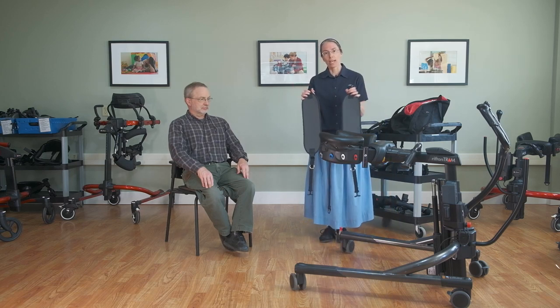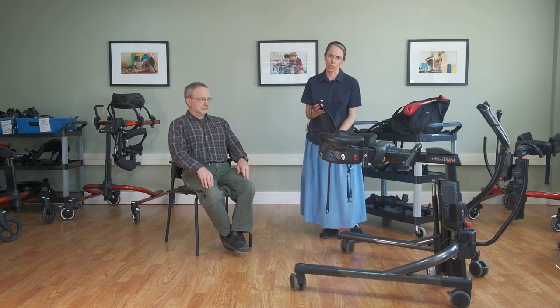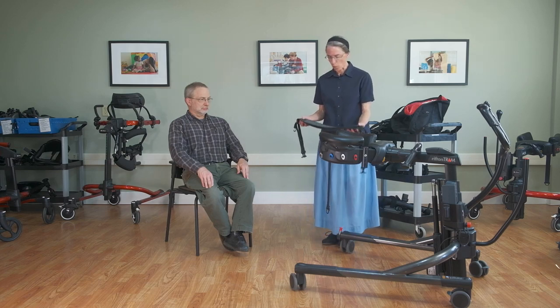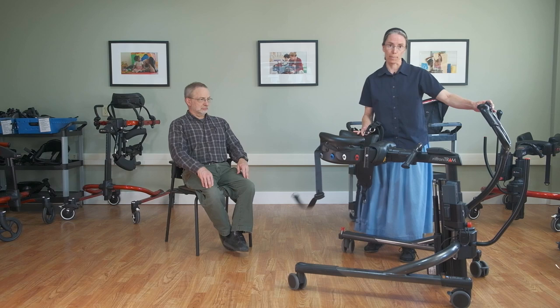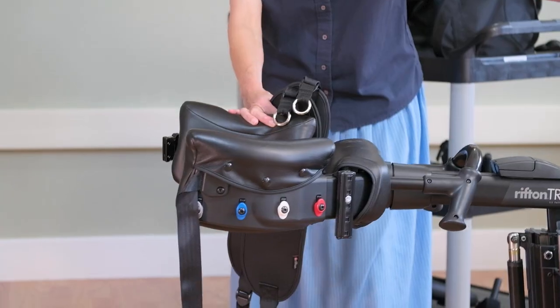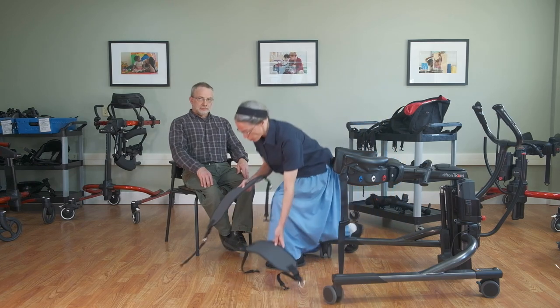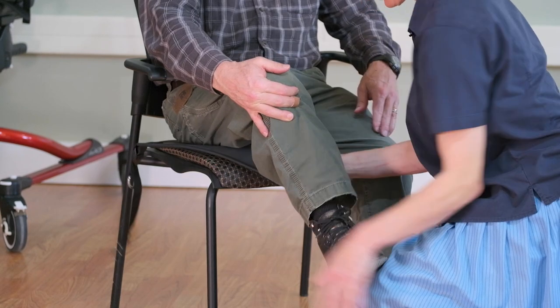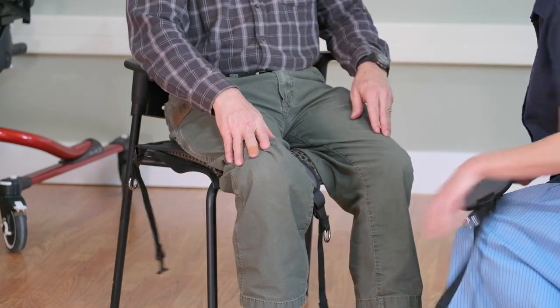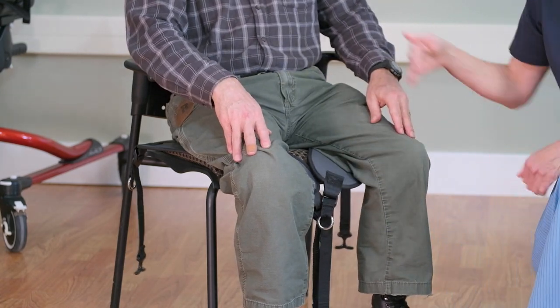With this seated transfer, the first step is using the thigh straps. There is no above-the-waist lifting, so there's no preliminary lift to get the student onto a sling. We're going to place the thigh straps initially and then secure the body support system around the student. You may even want to put the student's foot right on your knee so you can get the strap well underneath.